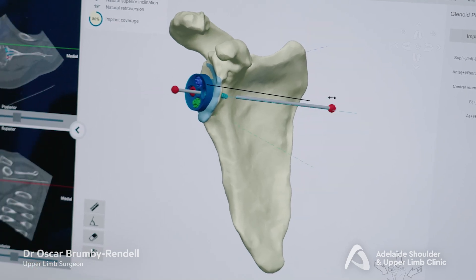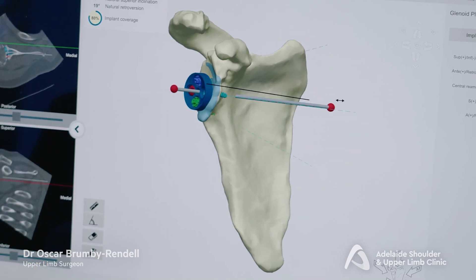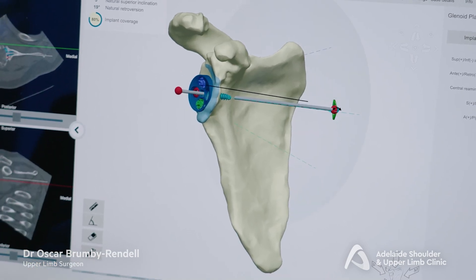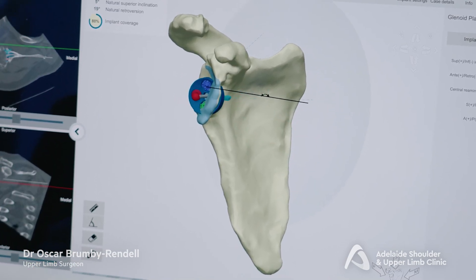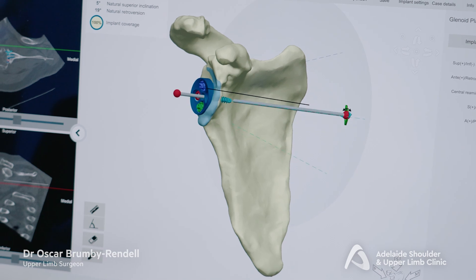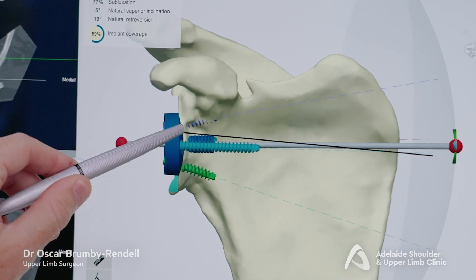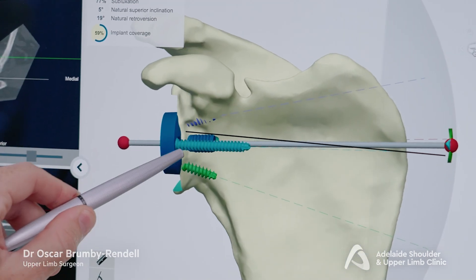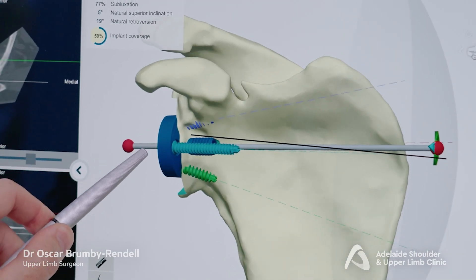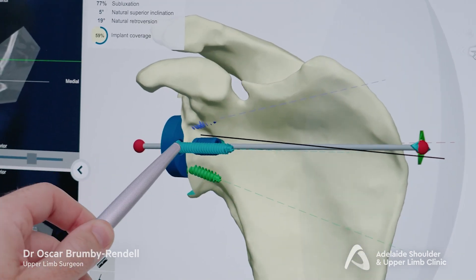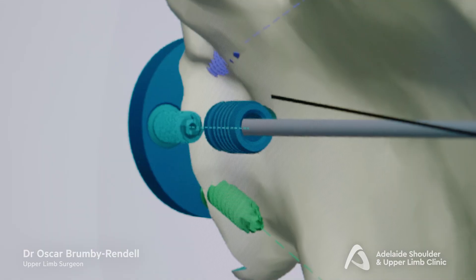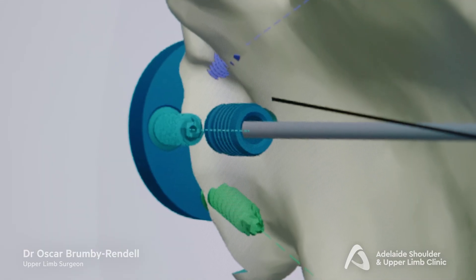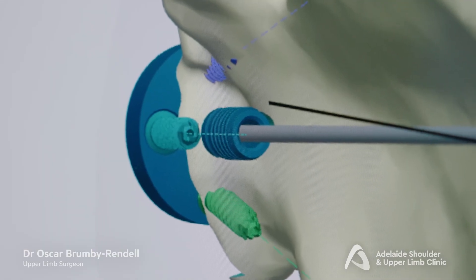Here you can see we can plan exactly where to put the components to ensure the screws and pegs will get excellent purchase in the bone. If the component was put in at a slightly incorrect angle, as you can see, the screws will be missing the best part of the bone to achieve fixation.